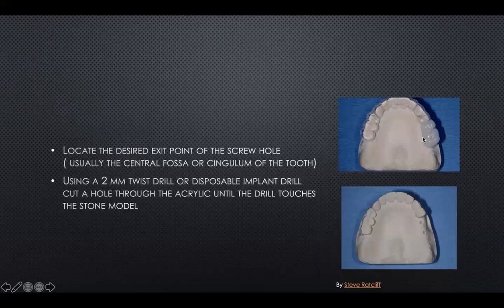And we're always shooting for a screw-retained prosthesis, whether it's a single crown, a partial denture, or a complete denture. For obvious reasons, we try to stay away from cemented crowns or cemented prostheses, because screw-retained ones offer two major advantages.